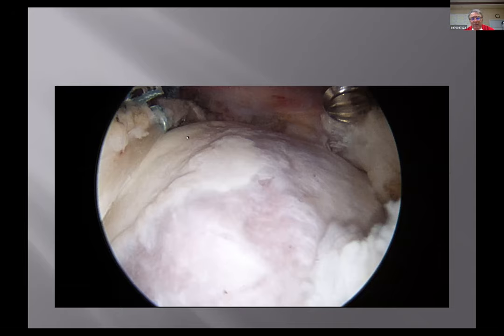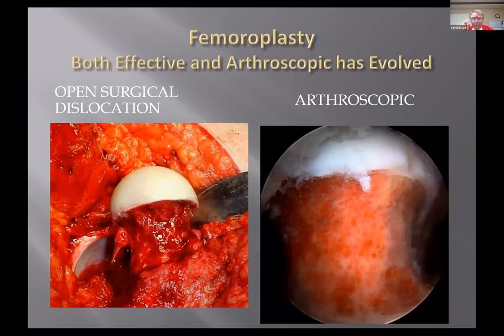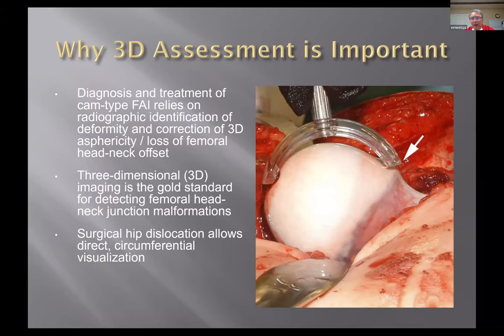Well, Mark Philippon teaches a goal line view, which is the view from the anterolateral portal. And then he comes down and makes a goal line. And then kind of like cutting your grass, he makes a rectangular view. This is what they do in Europe. They open the hip, they dislocate it, and they surgically remove that cam impingement. But when we're done, if we can do the same thing through a scope, we're accomplishing what they're accomplishing. When they do it open, they take these little C-shaped half moons, and they just say, hey, that's the impingement area, and they make sure they reproduce that.